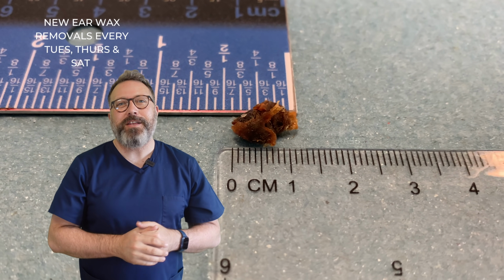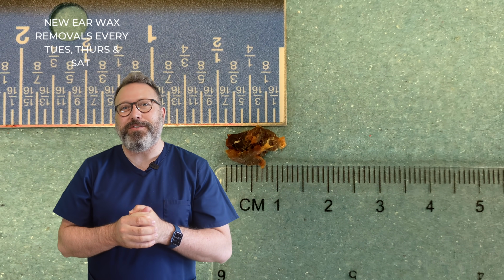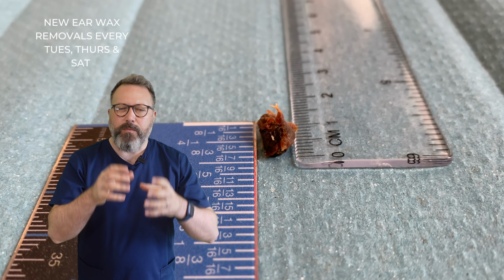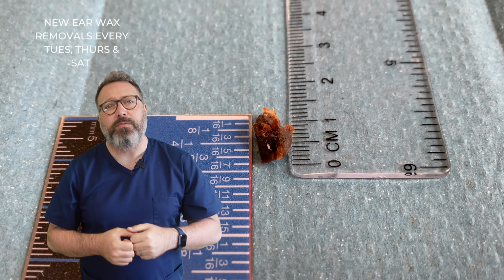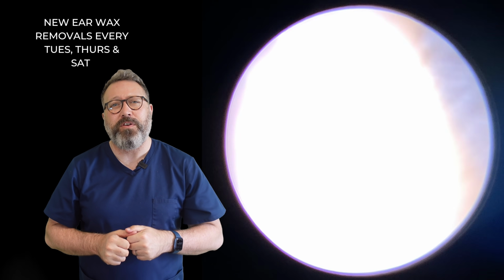So this is 1 centimetre's worth of wax. So we're going to call that 7/16 of an inch. I'm going to call that one, so just under half an inch, that one. Really tough little piece of wax, that one as well. It's been in there a little while, so it had really dried out and hardened up quite firmly there.